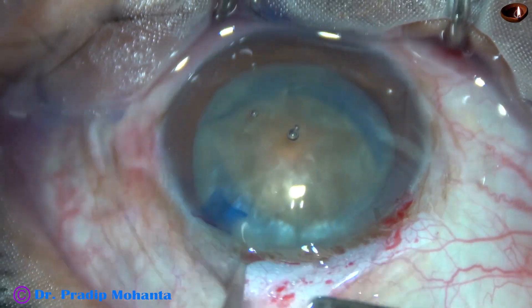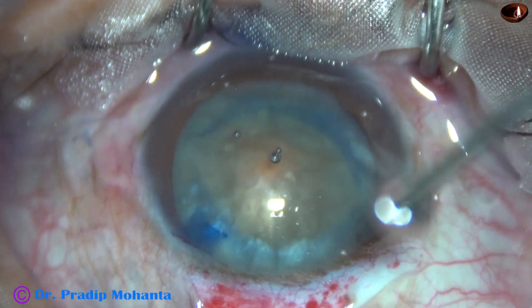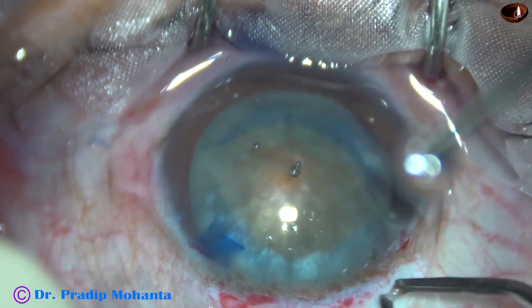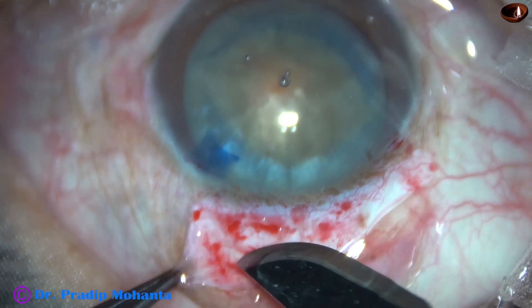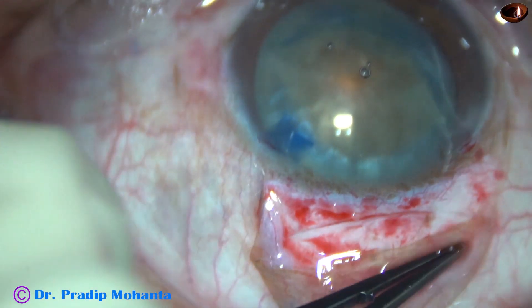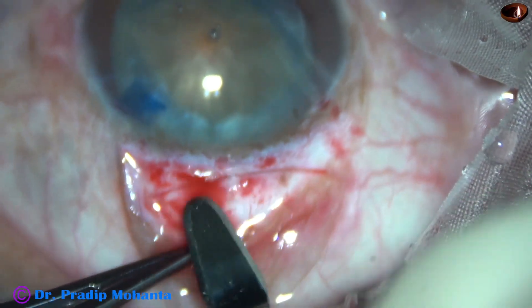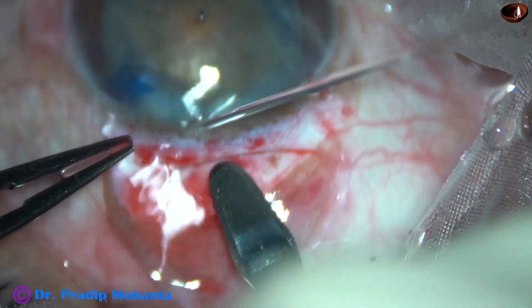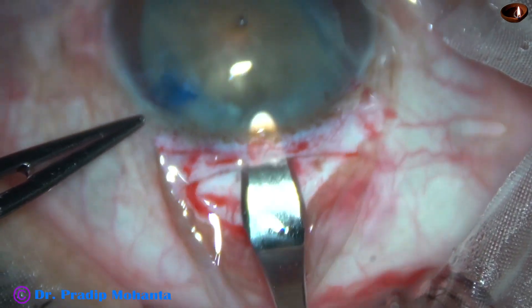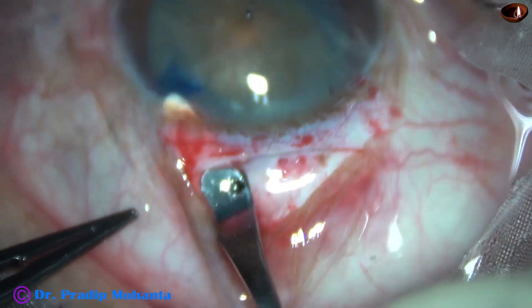Peritomy is done between the two incisions — the main incision and the side port. The cataract is grade 3+, so at least a 6 mm incision is made — a mild frown incision. A crescent blade is used to make the tunnel, and the tunnel is completed.